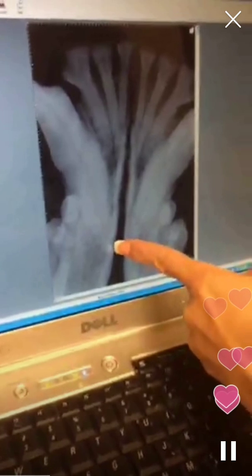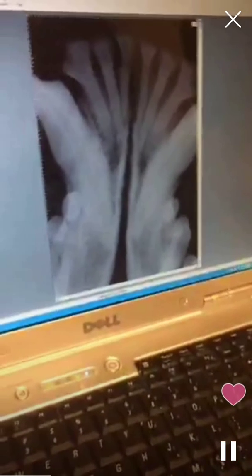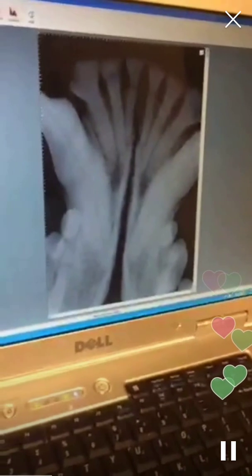So with this tooth, I never extract these teeth without x-raying them first, because you have very little supporting structure here. And sometimes if they're infected, you have very little supporting structure around that tissue that you're trying to remove. So it can be a very touch and go situation. So we don't have any pathology there.